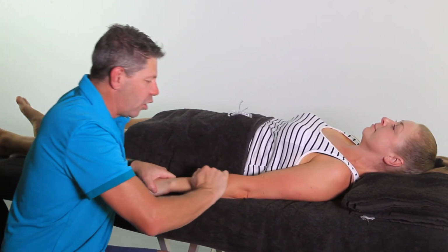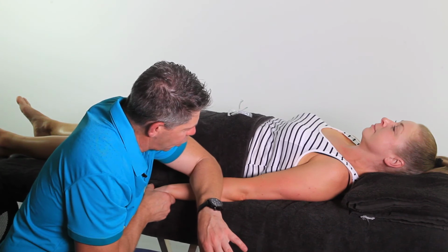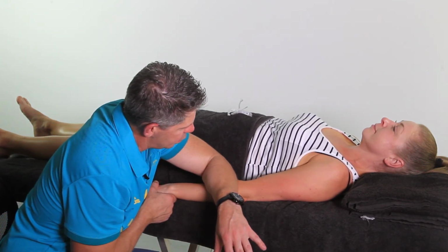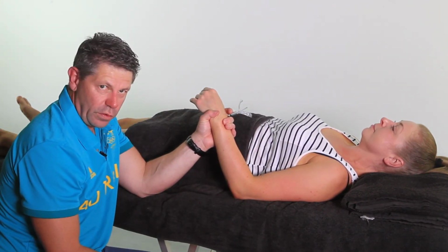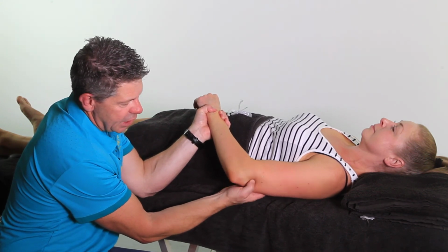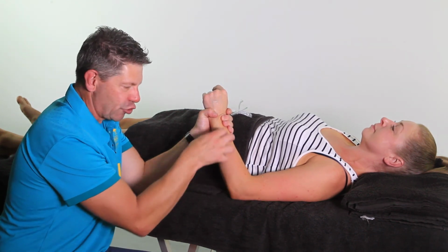Okay, so not unlike how we started. A little bit of wrist extension, bring over a broad forearm, and then work through that extensor carpi ulnaris. Like so. Okay, so that's dry needling for the extensor carpi ulnaris and associated other extensors as well. As I mentioned before, we've also got the triceps through here as well. They will also refer into the elbow, so that is another part of our treatment sequence as well.